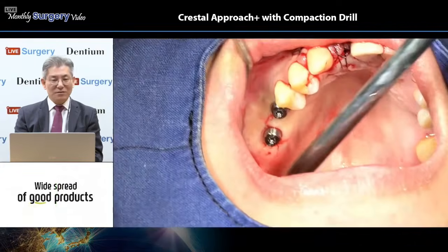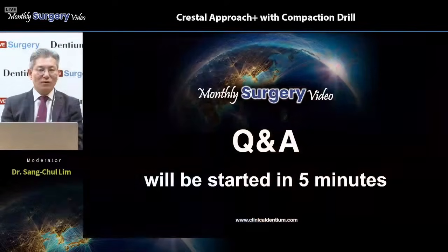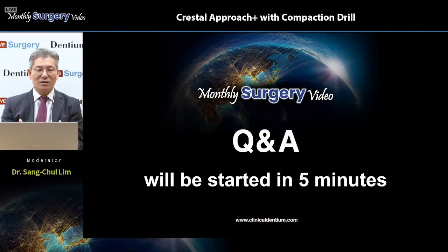Okay, for the final restoration case, when we have a final restoration type, it's a totally different story. At that time, we're going to use the hex scan comfort cap or scan abutment. However, like this, just after surgery, the non-hex type is better to use, and the connection.